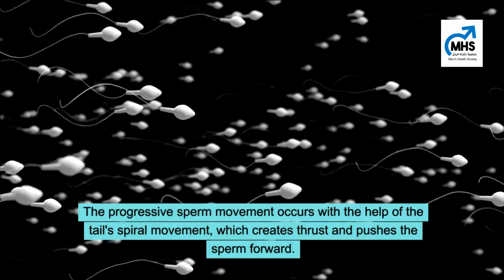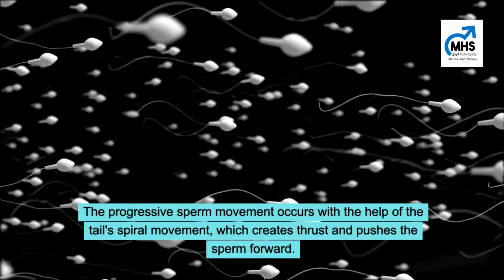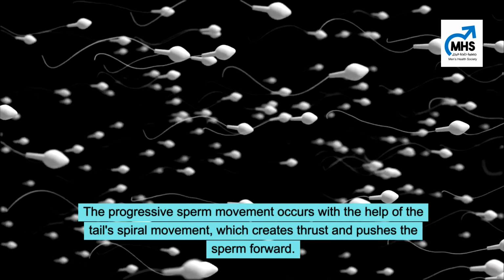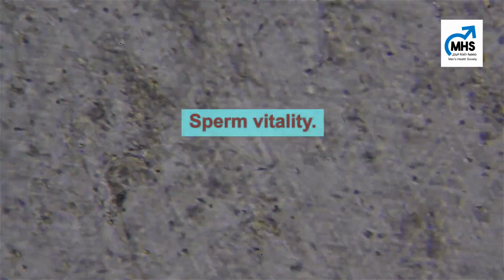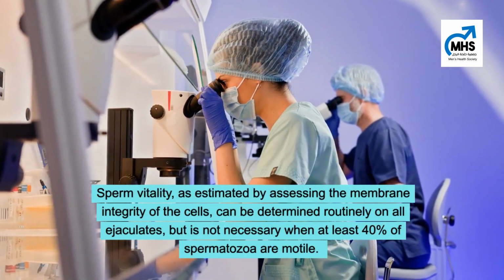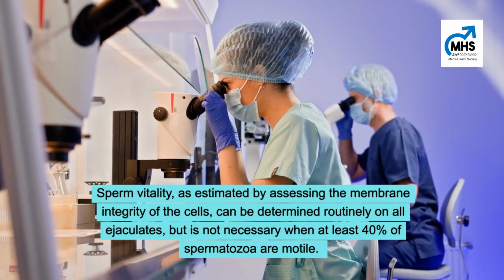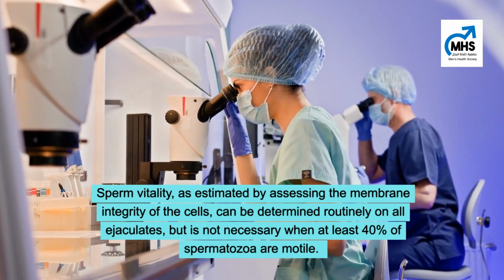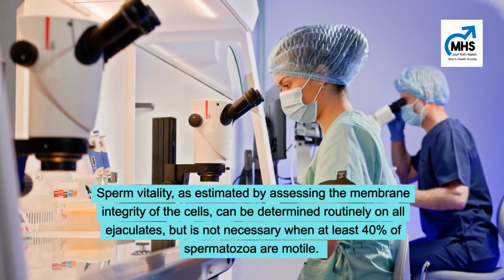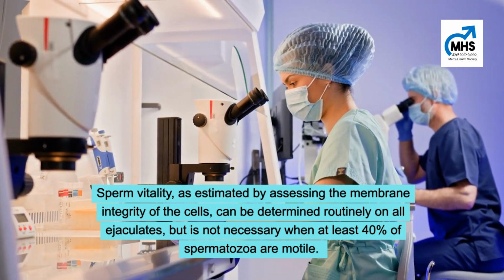The progressive sperm movement occurs with the help of the tail's spiral movement, which creates thrust and pushes the sperm forward. Sperm vitality. Sperm vitality, as estimated by assessing the membrane integrity of the cells, can be determined routinely on all ejaculates, but is not necessary when at least 40% of spermatozoa are motile.